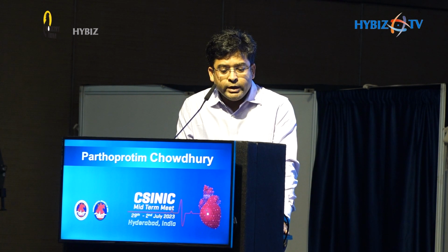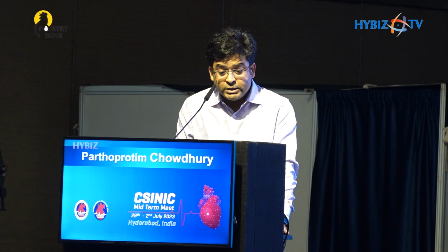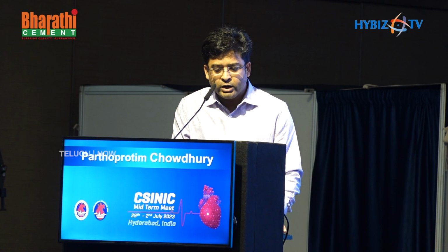Basically, sometimes we have a non-selective engagement of this anomalous artery. What we can do is put a wire inside, then take a guide liner so that we can complete our procedures. This is a good example where we use the Sherpa-NX. Sherpa-NX has multiple curves, and even its shaft is bent. So when you are encountering an anomalous RCA with tortuosity, it's a good option. It fits into the aorta very well.